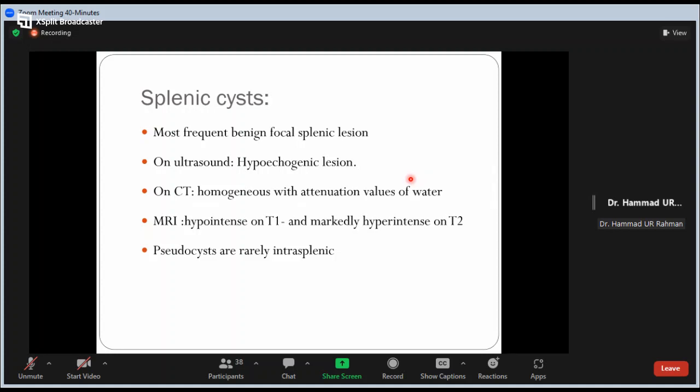And you know, pseudocysts sometimes can also be present in spleen. They can also be present even in thorax. I have seen a few cases where pseudocysts are located at very odd locations. But characteristics of pseudocyst would include slight shading on T1 weighted and T2 weighted image because of its proteinaceous content, and it may be loculated with internal septa etc. So let us move to the second slide.